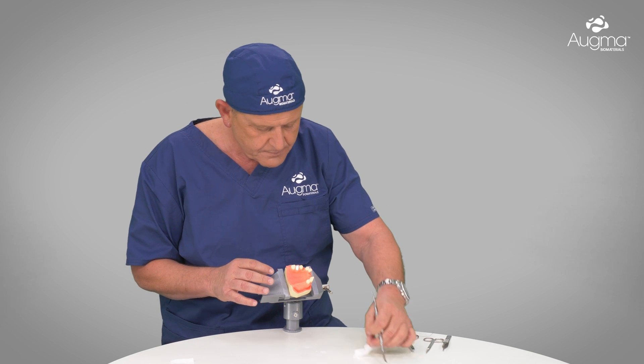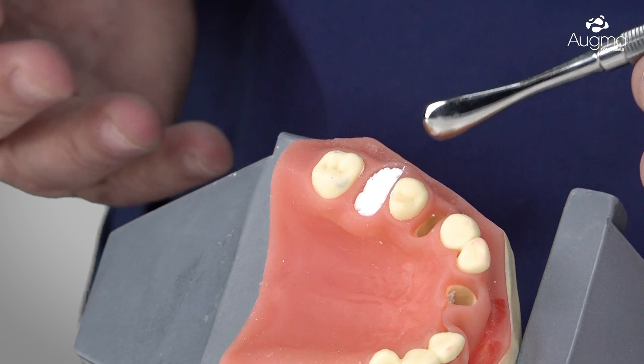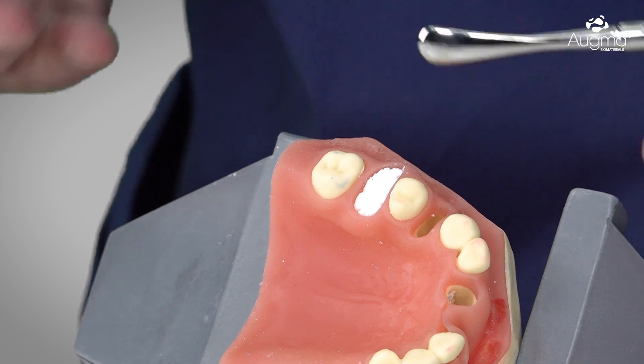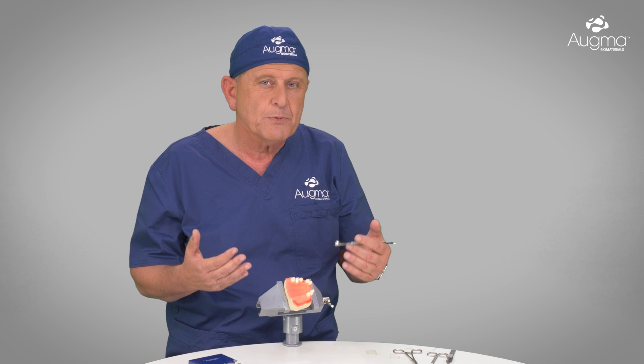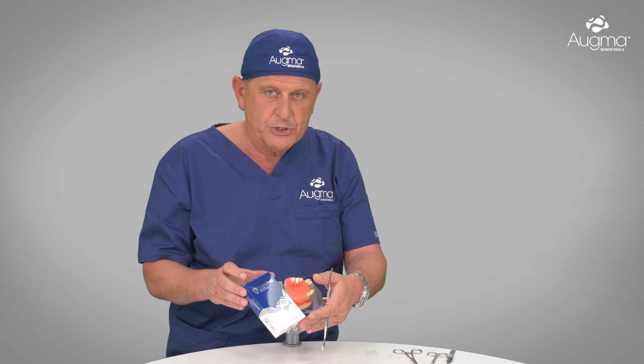It is very important that the material is well compacted at the cervical level, again for 3–4 seconds — no more. At this moment, we finish our socket grafting procedure. However, the bone graft cement cannot be left exposed more than 3 mm. If it is exposed more than 3 mm, we must protect it with the Augma Shield.